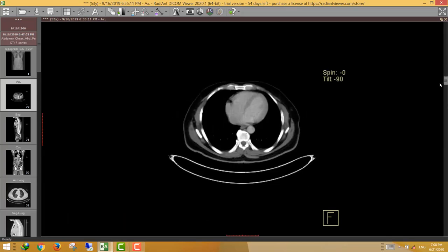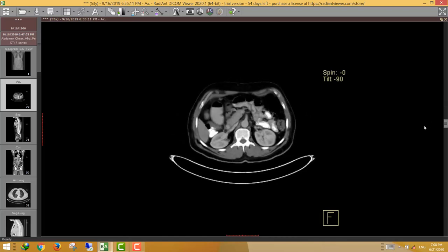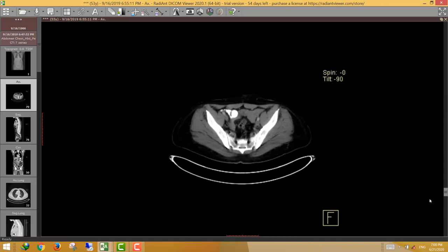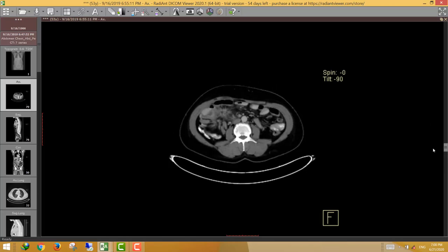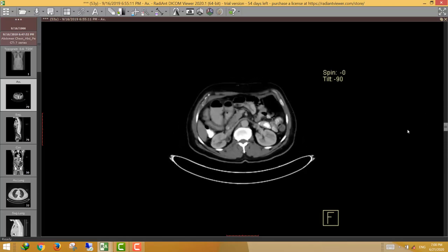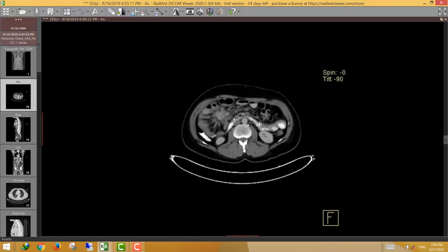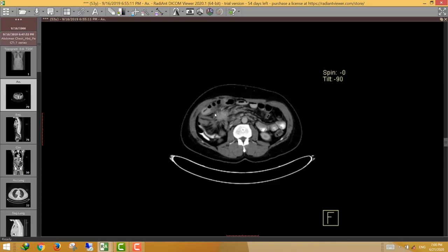This is a 53-year-old male who had a CT abdomen and pelvis. At the right lumbar region, there is a spiculated mass lesion in the mesenteric fascial planes associated with multiple smudging and stranding of the surrounding fascial planes. This extensive smudging and radiating bands are typical for desmoplastic reaction.